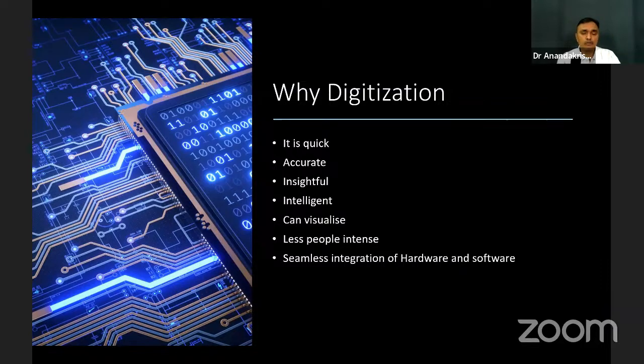But today, what we are seeing is when you do the scan and send it to the laboratory, it is almost automated, in the sense there is no model making for single tooth crowns. You can just make it modelless. You can go ahead, design the crown, mill it, polish it or glaze it, and send it back. You're not even layering in most cases. In more than 95% of situations, you are not having layered crowns. That's how dentistry is moving today.